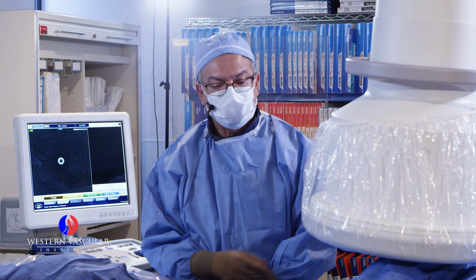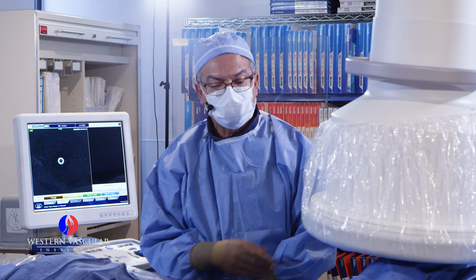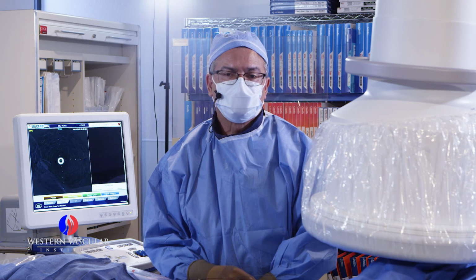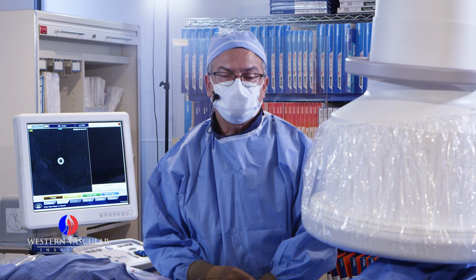At the end, I will use a little closure device for the puncture site. And from here, actually, she's going home. So definitely there's a big difference between the two approaches.